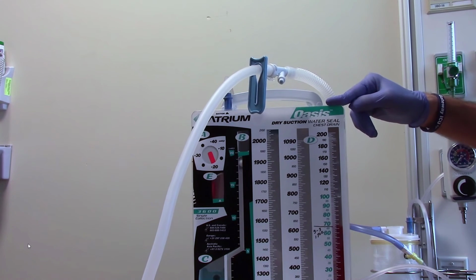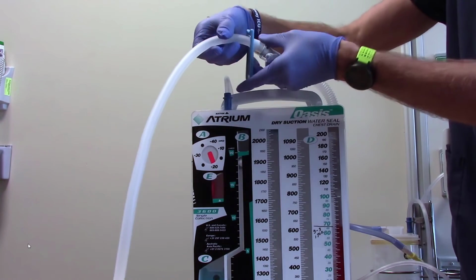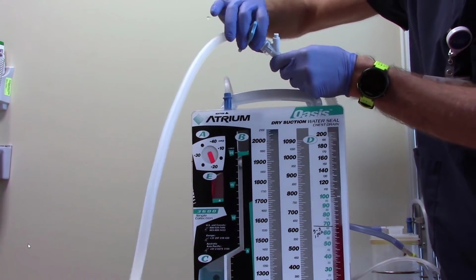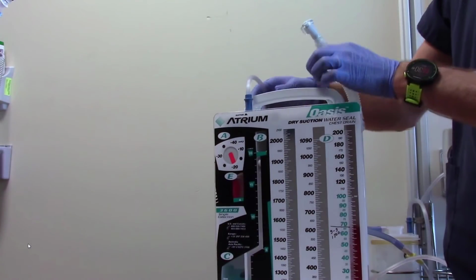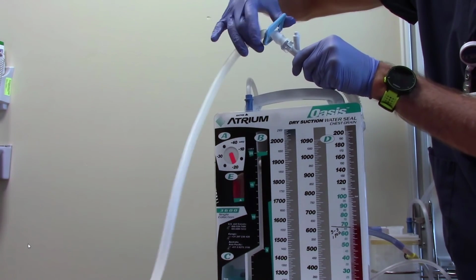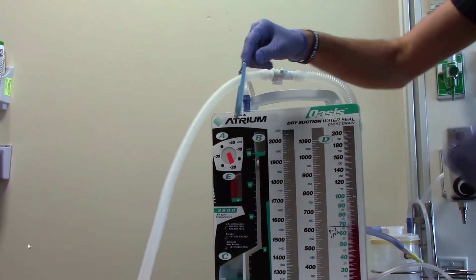If you need to change out the chest tube drainage system because it's full or it's tipped over, you disconnect by clamping the tubing, pressing on the clear button to disconnect, and take the chest tube system that's already been prepared and connect it quickly. You do not want to leave that tube clamped except for a brief period of time.